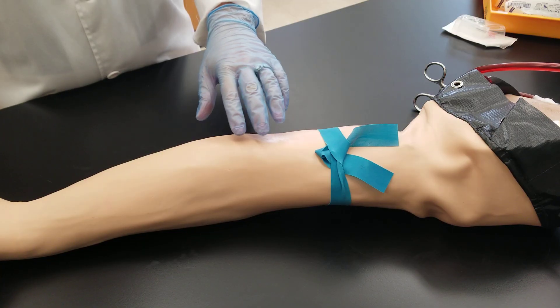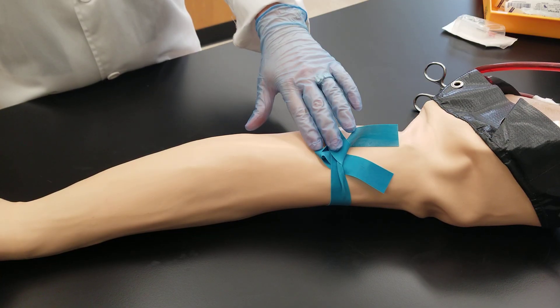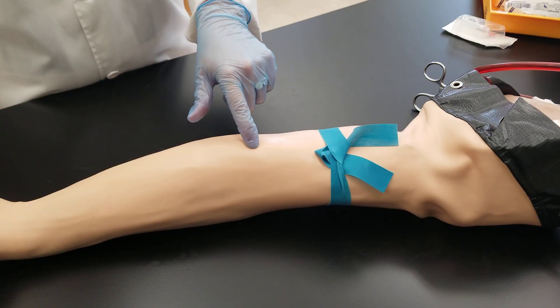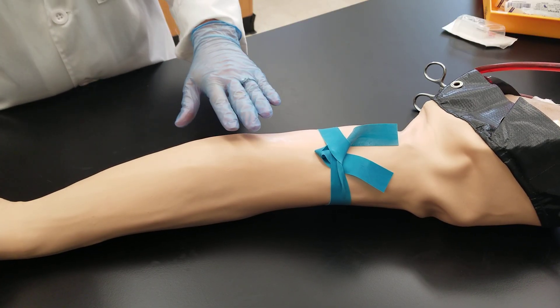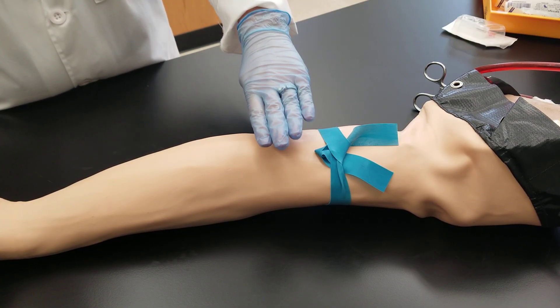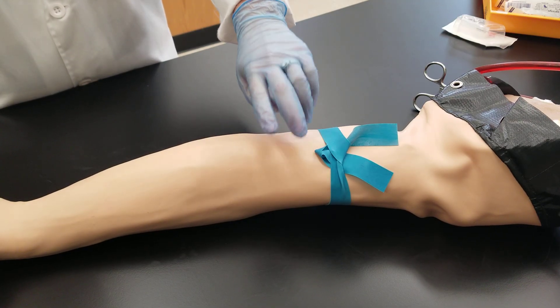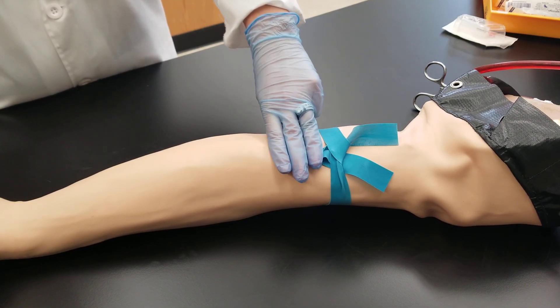What you want to do is apply the tourniquet three to four inches above the draw side of where you're going to draw the patient. A good rule of thumb is four fingers for someone who has small hands like myself and three fingers for someone with larger fingers.